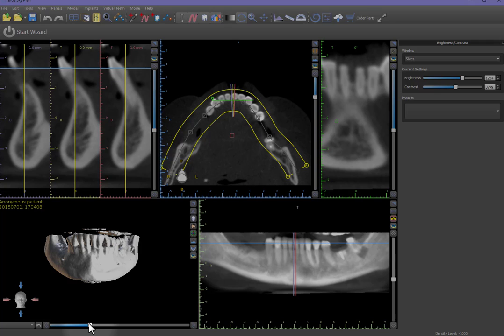The 3D view can be cleaned up by left-dragging on the density threshold slide bar found beneath the 3D image. Dragging to the right increases the threshold, thereby showing only the higher density portions of the scan.